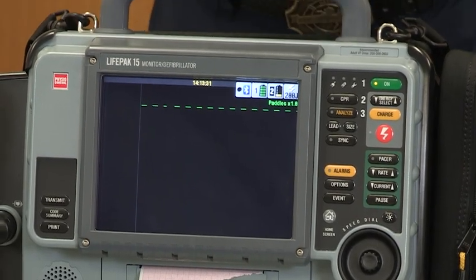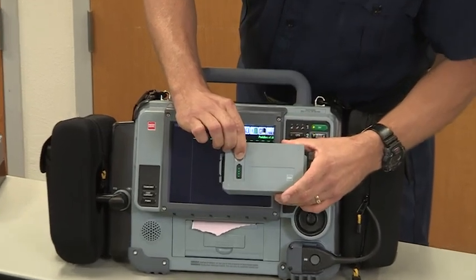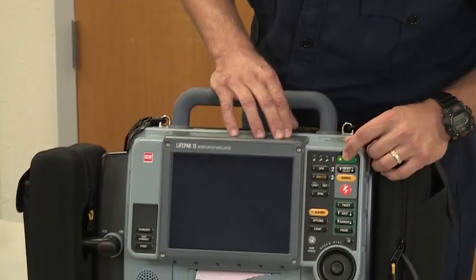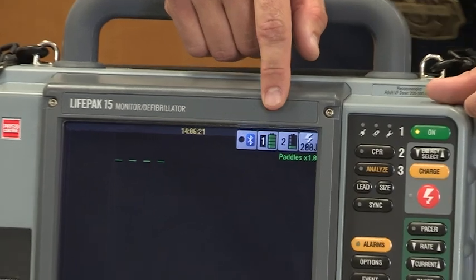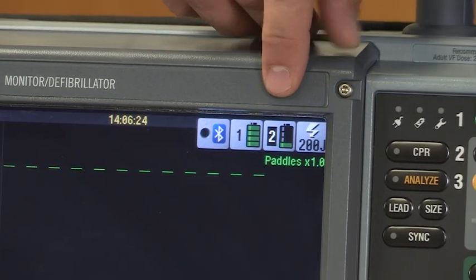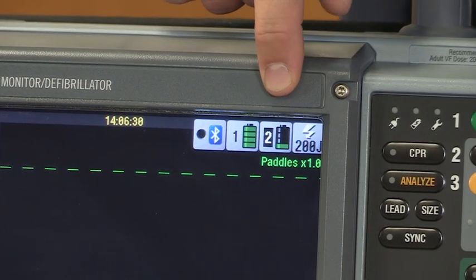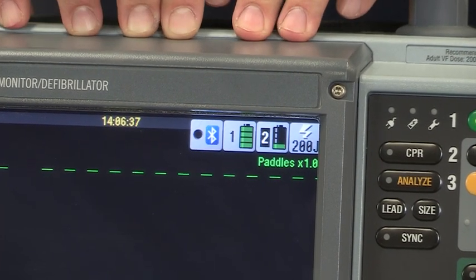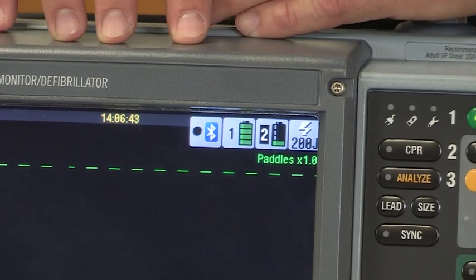You'll recall earlier I demonstrated to you a way to check the charge level on a battery by simply depressing the button on the back of the battery, and it will show you the charge left or the charge remaining in the battery. On the LIFEPAK itself, when it's turned on, we can also see battery indication of how charged they are or how empty they are. You'll see here battery number 2 is in use, and that's indicated by the white number surrounded with a black box. The LIFEPAK itself will automatically use the lowest charge battery and save the highest charge battery as a reserve and backup.